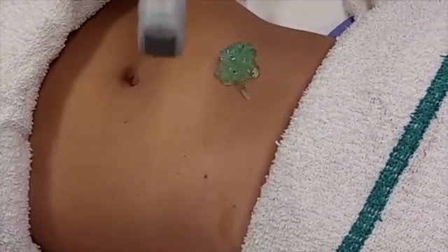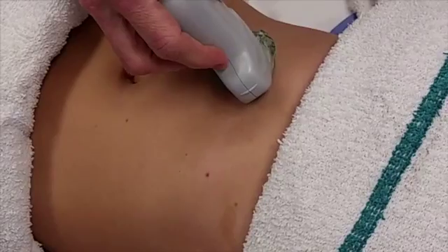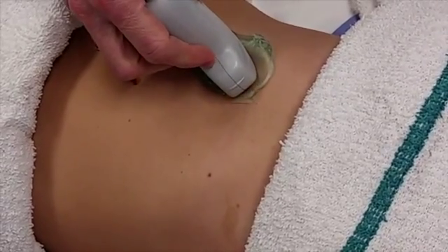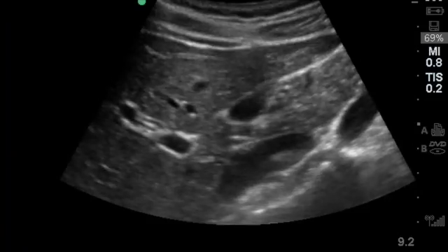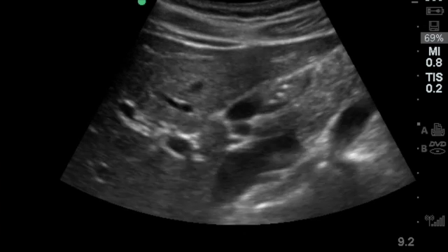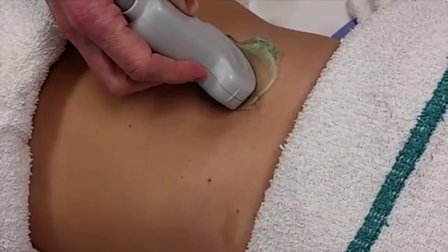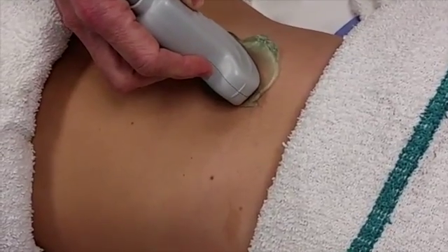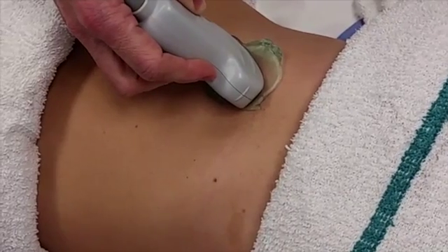Place the probe in line with the ribs under the right costal margin, probe marker pointed towards the patient's right. If you see liver, you are good. If you see bowel, which looks like a bunch of random shadows, you need to have the patient take a deep breath to slide the liver down towards the probe. Have them hold their breath while you do the scan.